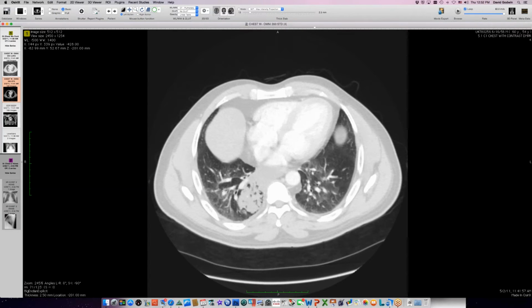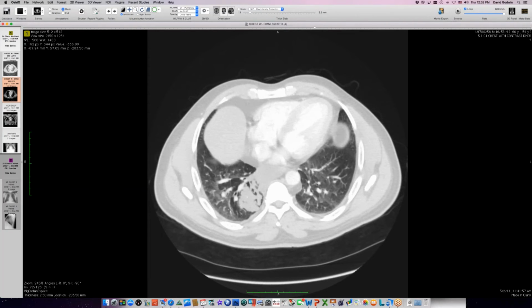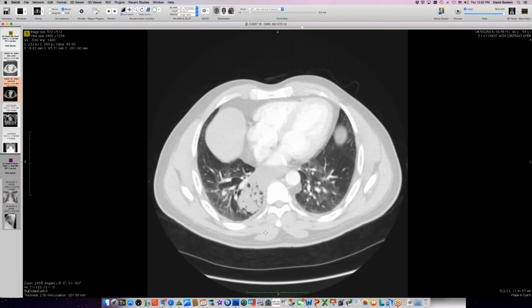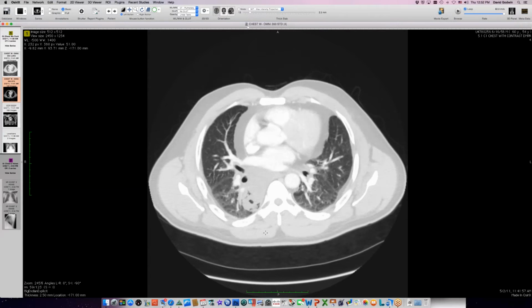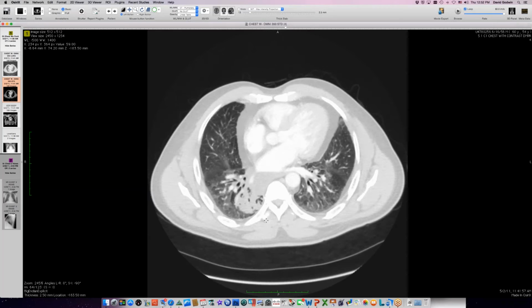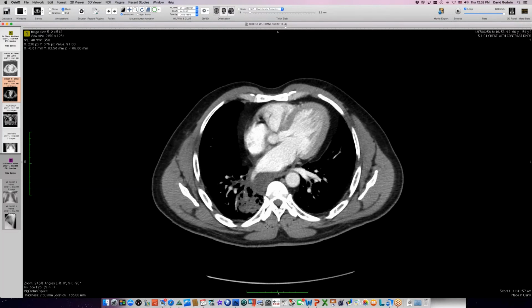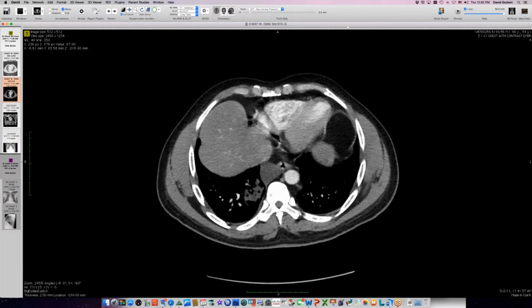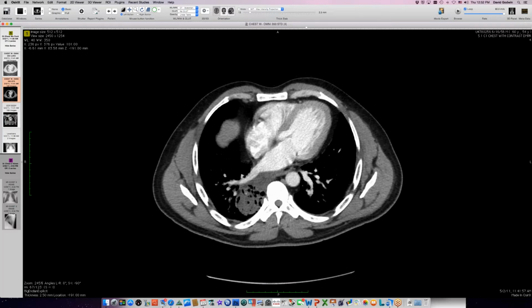And everything has stayed very clean around this thing. The person does not have symptoms of chronic infection. This is really almost an incidental finding on these scans that were done for some other reason. And there's long stability to it. I didn't see any blood vessels entering this thing, systemic blood vessels getting into it.